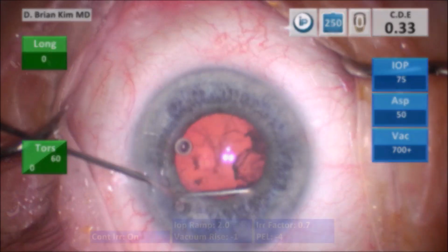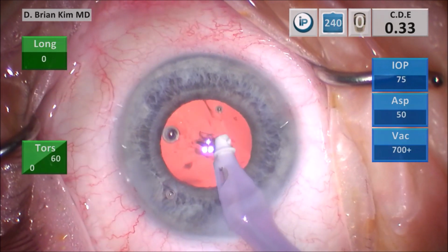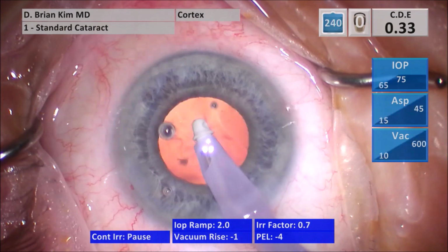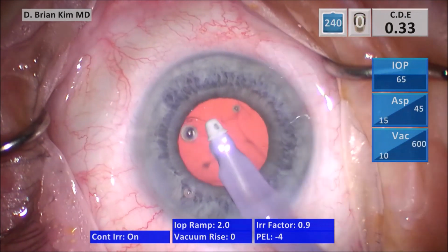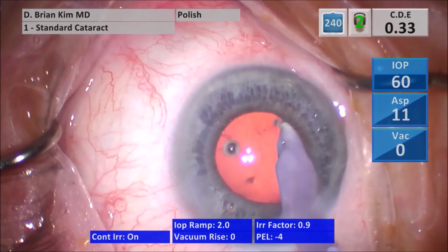I am starting subincisionally. You can see there's not much cortical material in this case, and I'm going to sweep underneath. In these contexts, again, when I don't have good peripheral view, I am afraid that the IA tip, rather than grabbing cortex, may grab the capsule and actually pull on the capsule and thus the zonules.